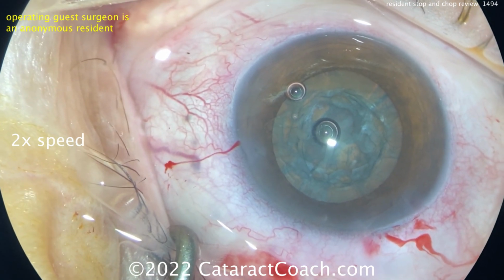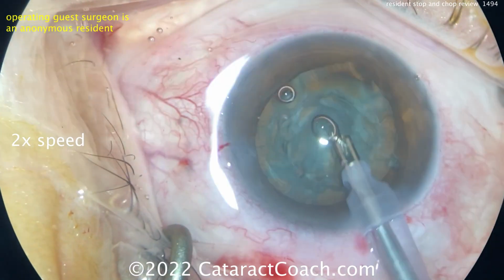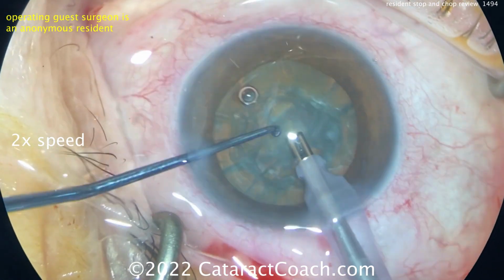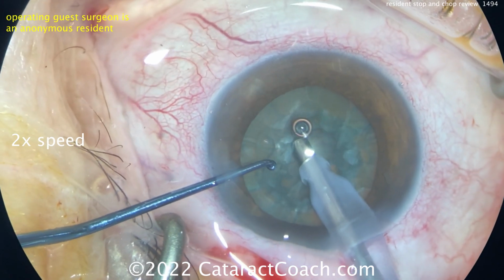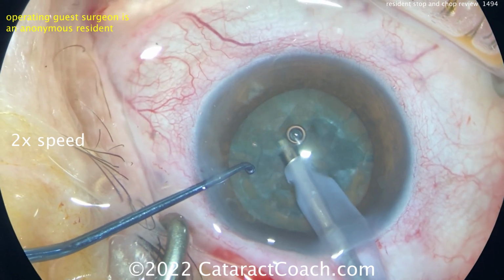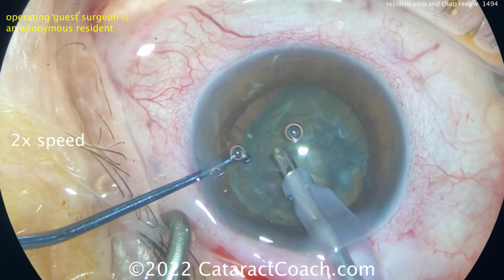And now once you have the two halves done, you need to just bring up each half. So back into the phaco probe. Here comes the chopper again. And I don't like these ball tip choppers, but it's a reasonable approach, especially for a beginning surgeon. I don't mind using that. You figure out what works best in your hands.